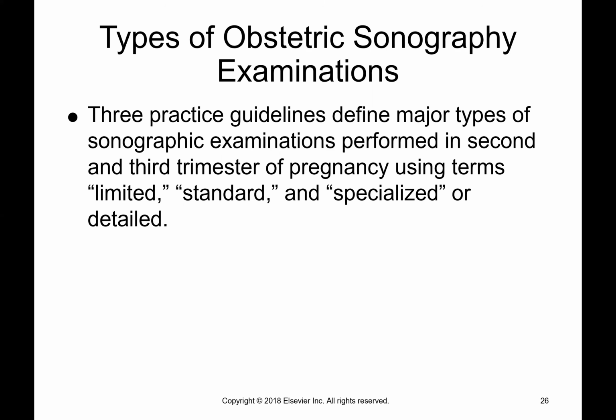We do a standard scan. Now, this is the one that you guys mostly know from gender reveals, which you'll get the pleasure of being able to do for patients a lot. A standard scan basically is where they come in from 18 to 20 weeks, and we just make sure everything looks good with the baby. They get to find out the gender at that time if they want.